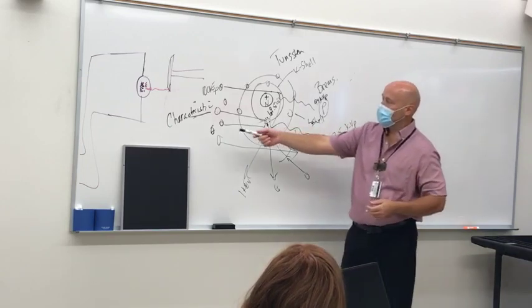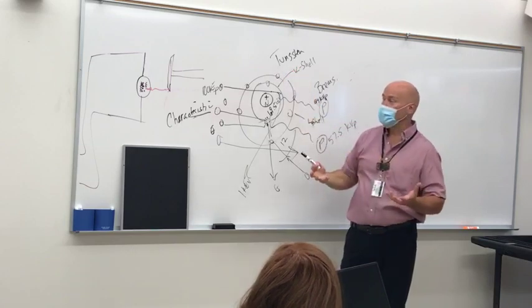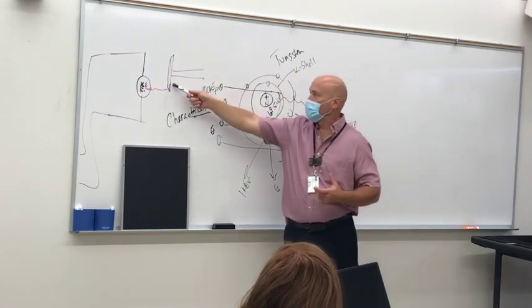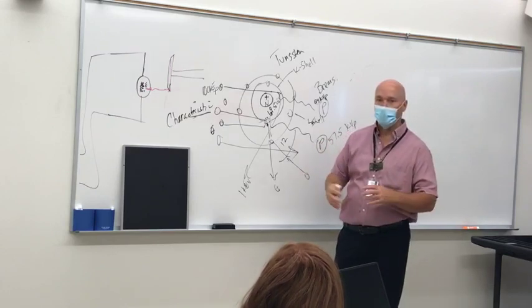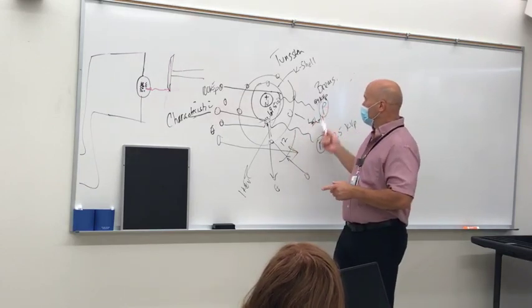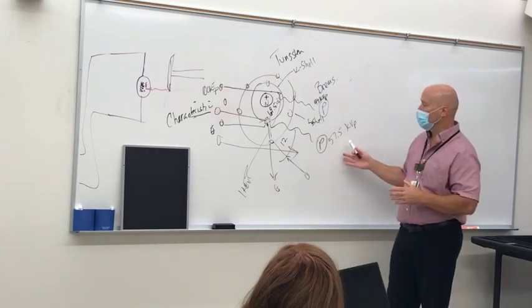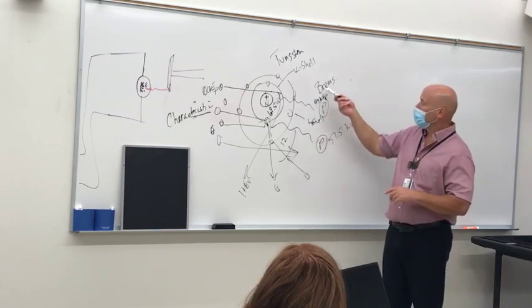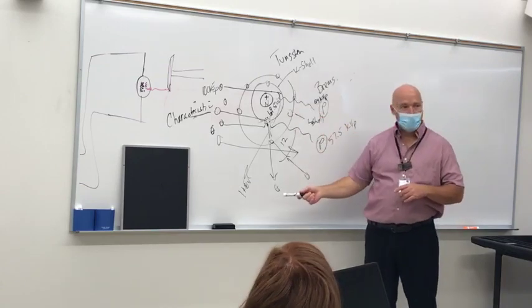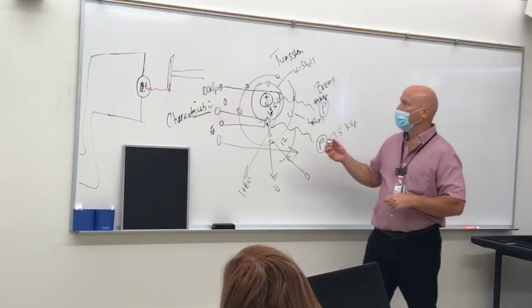One is characteristic. It's characteristic of the tungsten atom. If we change the type of target that we use, then our characteristic spectrum will be totally different. These are going to exist at specific intervals or specific energy levels based on those binding energies. But the brems, which are based on the slowing down, can exist at any energy level.